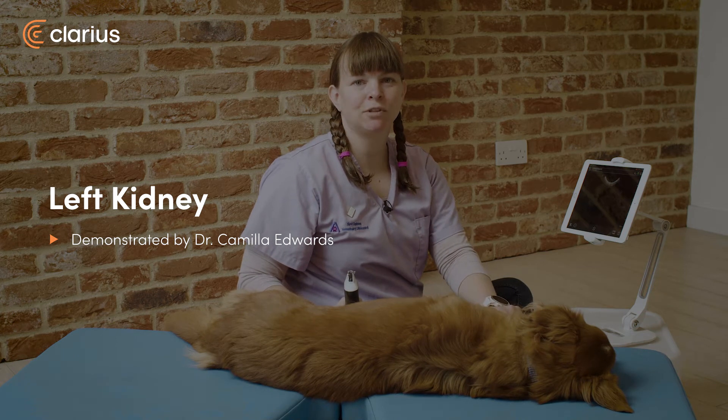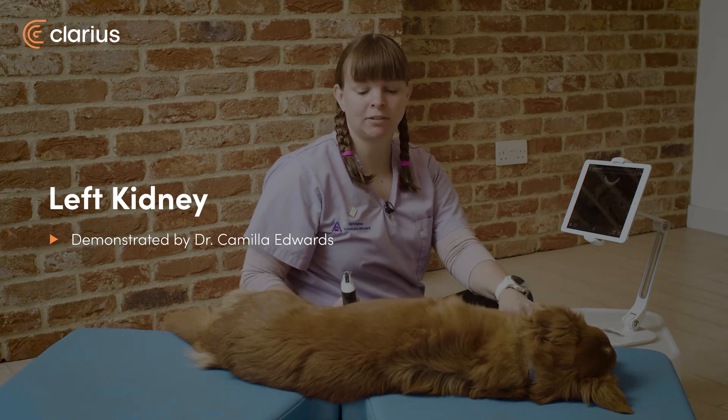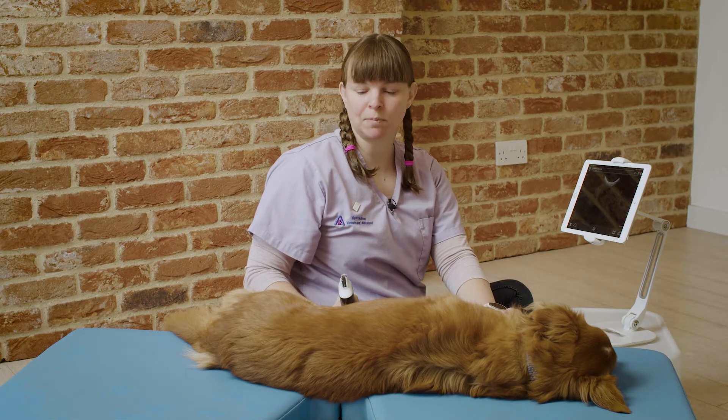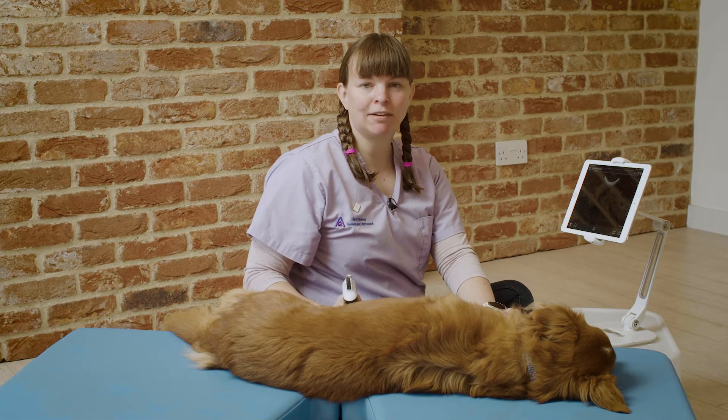Hello, my name is Dr. Camilla Edwards from First Opinion Veterinary Ultrasound, and today I'm going to teach you how to scan the kidneys and the bladder. We'll start with the left kidney.